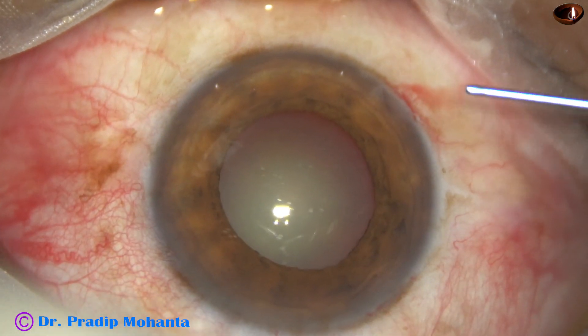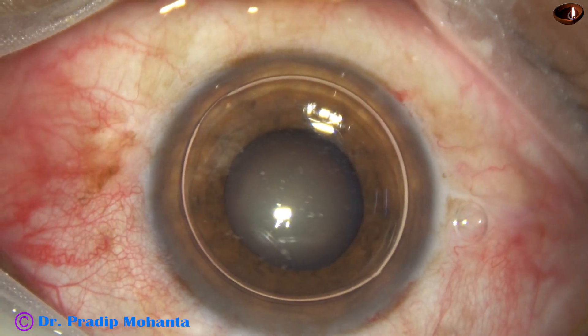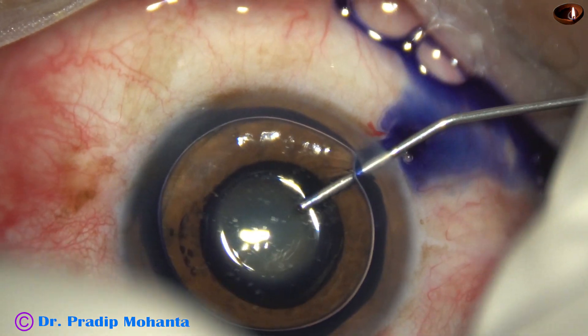And now an air bubble is injected into the anterior chamber. And then trypan blue dye is applied over the anterior capsule.